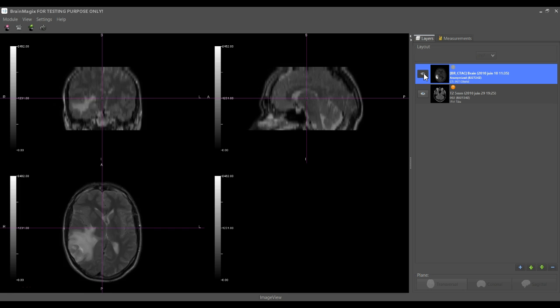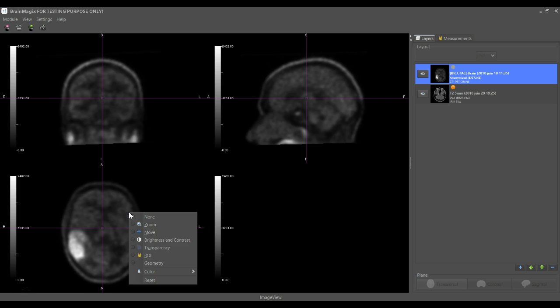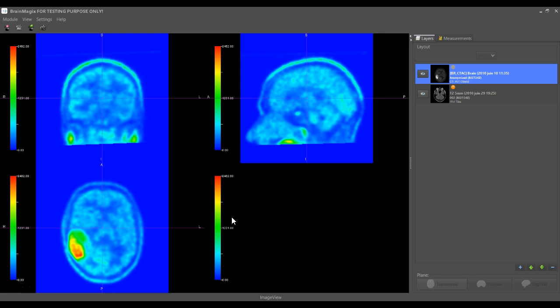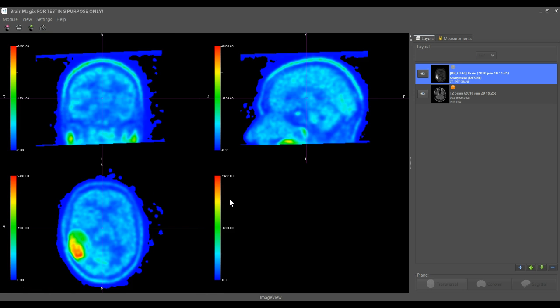You see that now it looks much better. We will color-code the PET scan: right-click, Color, Rainbow. We can also set a transparent background to avoid this blue color.